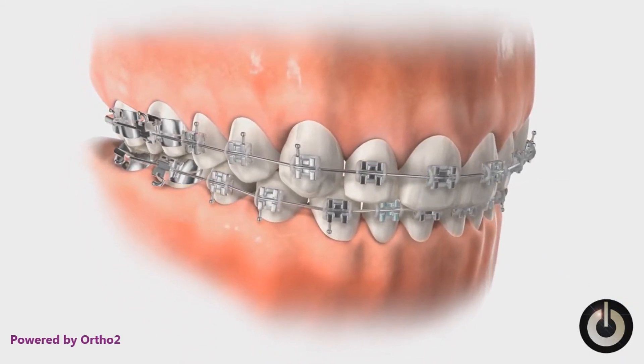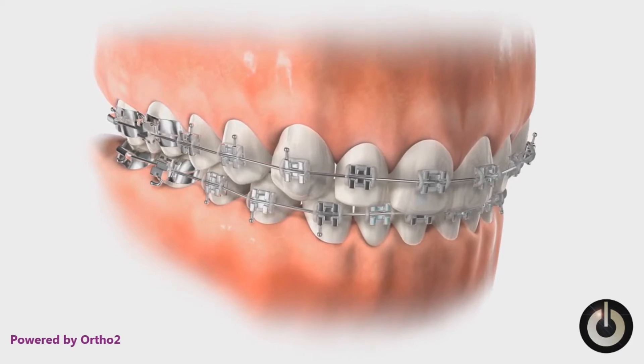Using the same brush head angles and motion, clean the remaining teeth until all buildup is removed.